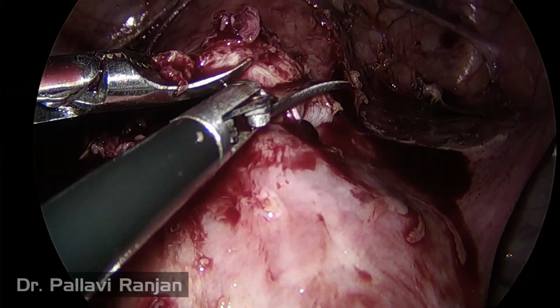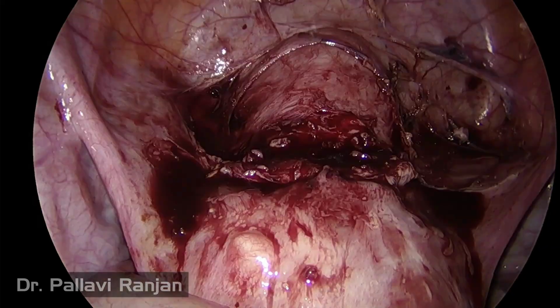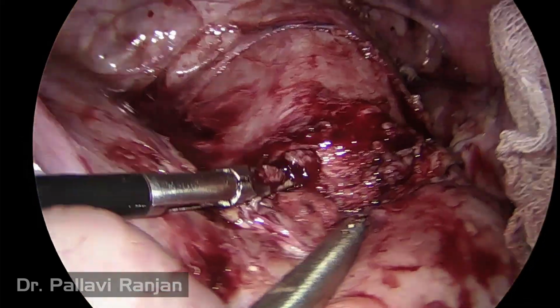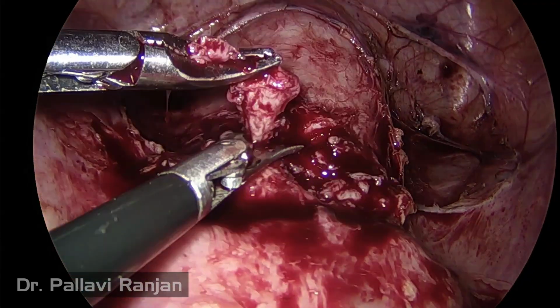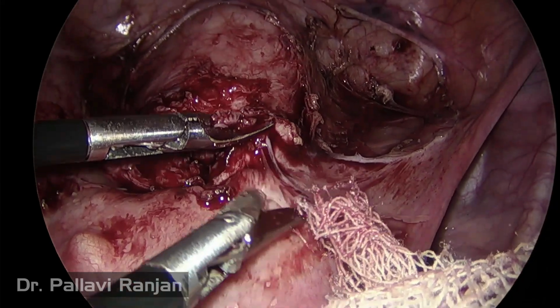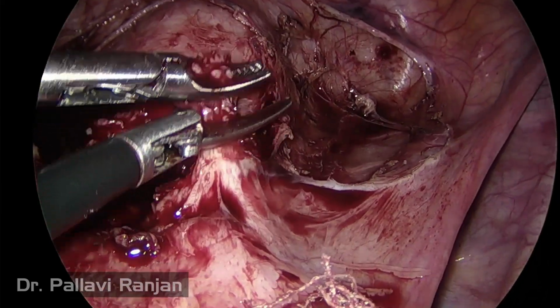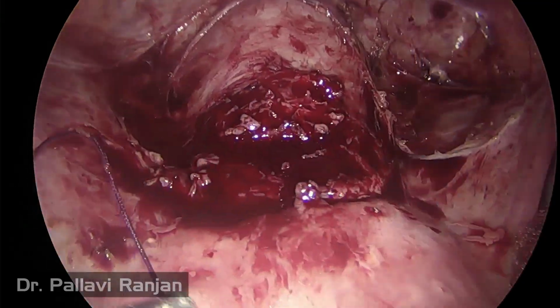If you don't refreshen that and remove it, the chances of isthmocele formation and recurrent scar pregnancy will become more. Once we are done with refreshing the edges, we ensure hemostasis, and we are here using a gauze piece to clear the area. And now we are going to suture both the layers.